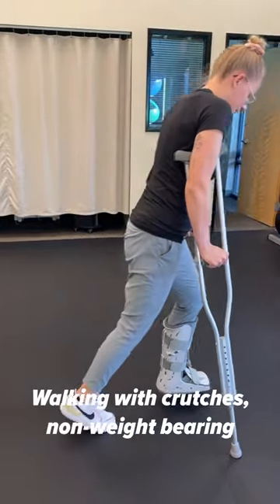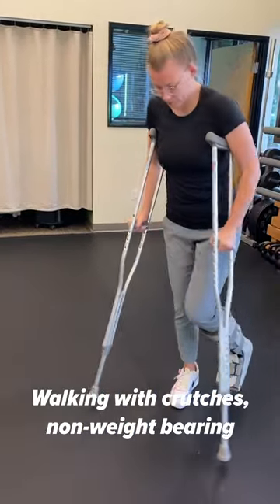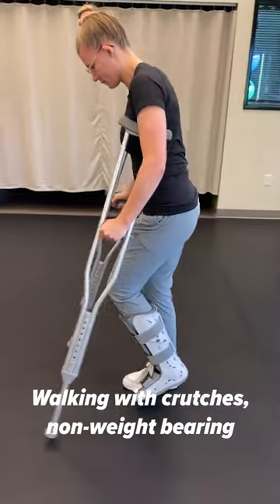What we want to do is have you tucking the pad up against your side with your arms just a little bit, so you're stable.